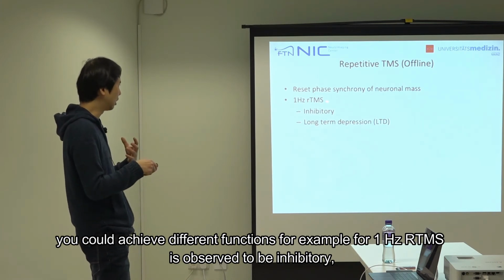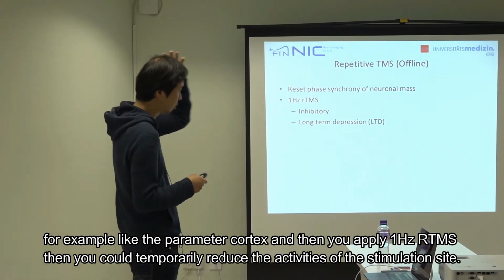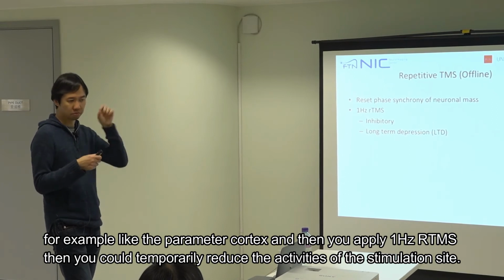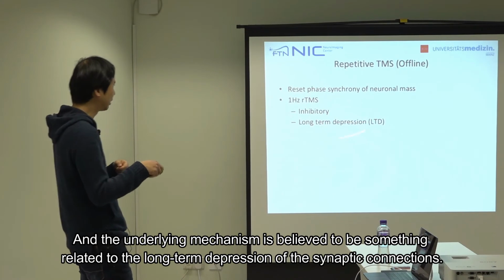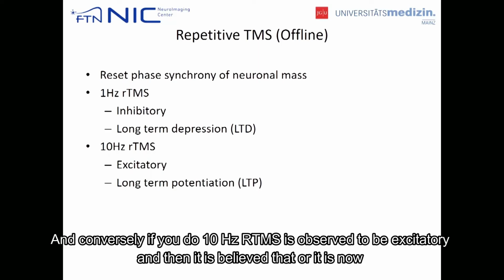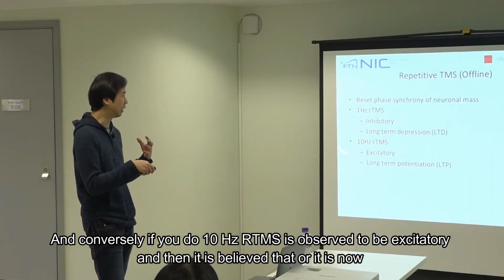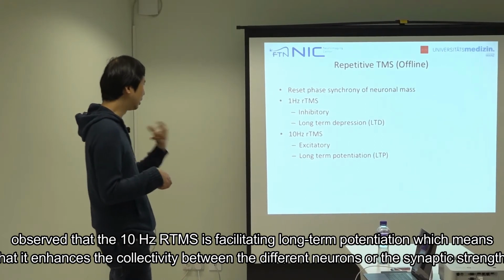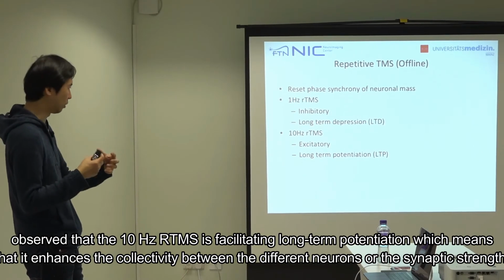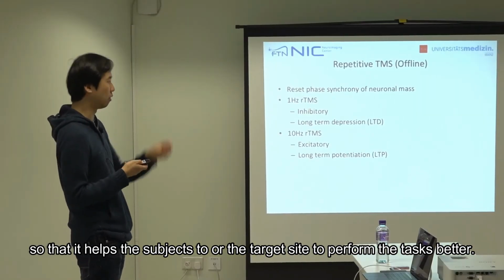By using different frequencies of this rTMS, you could achieve different functions. For example, 1 Hz rTMS is observed to be inhibitory, which means that when you put the coil over a certain region, for example the primary visual cortex, and apply 1 Hz rTMS, you could temporarily reduce the activity of the stimulation site. The underlying mechanism is believed to be related to long-term depression of the synaptic connections. Conversely, 10 Hz rTMS is observed to be excitatory. It is now observed that 10 Hz rTMS facilitates long-term potentiation, which means that it enhances the connectivity between different neurons, or the synaptic strength, so that it helps the target site to perform the task better.